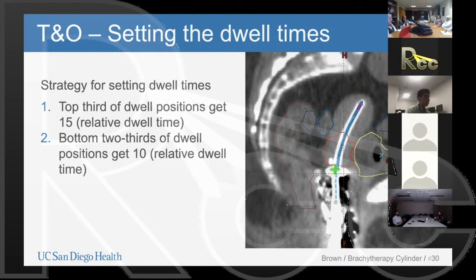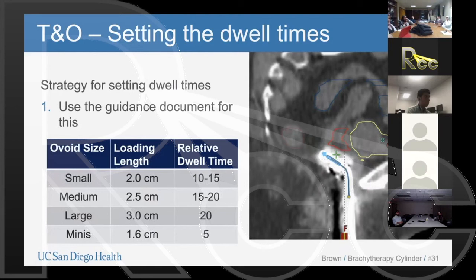We're gonna change those times based on that point A that we talked about. And here's our loading strategy for the ovoids. It depends very much on the ovoid size that we use.